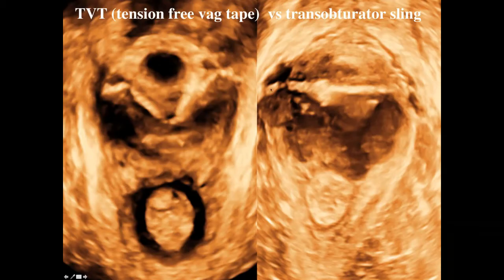This one goes straight across, and this is an obturator sling, and this is under some tension from the obturators on either side, and it goes straight across, and the urethra is up here, and that's under some tension. This one is called tension-free vaginal tape, TVT, and it is slung around this way without the tension that you see in the obturator sling. Now, I'm not a urologist or a urogynecologist, so I'm not going to go into much detail because I don't have the detail about how these exactly work mechanically. But that's how they look.